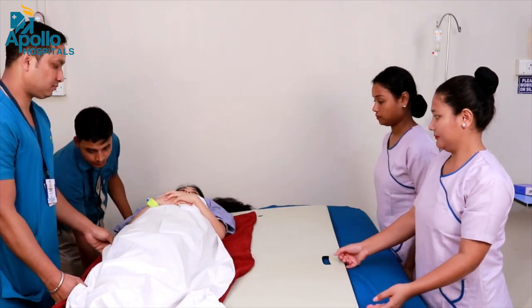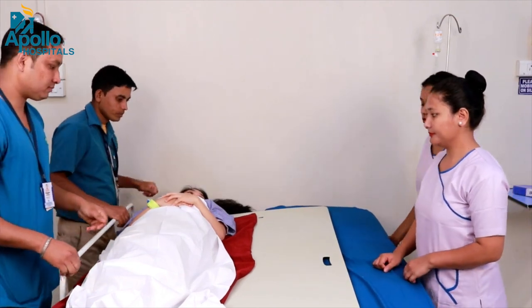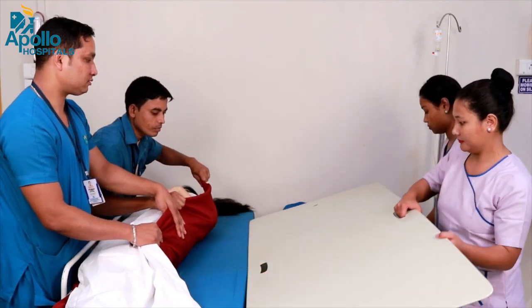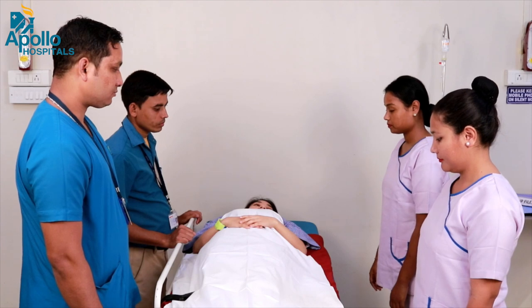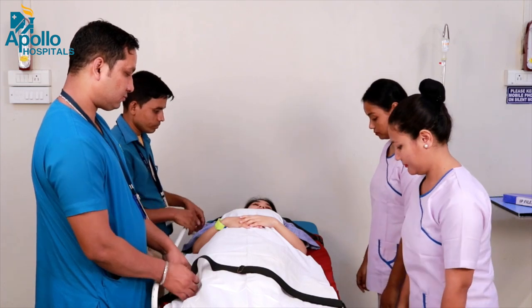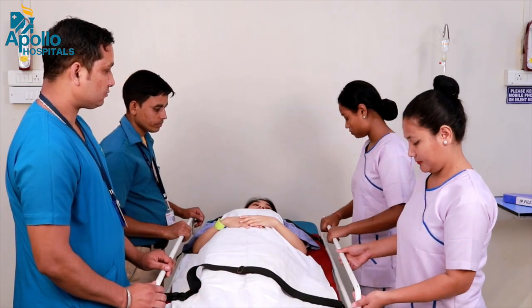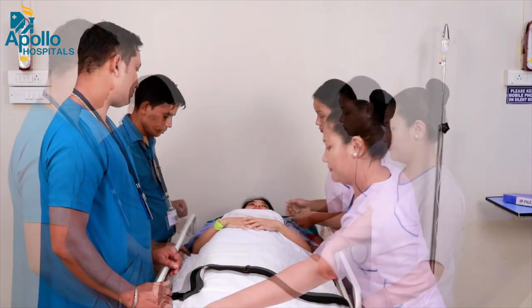Provide side rails to the patient. Put on the safety belts. And put the side rails of the patient in a comfortable position to the patient. Thank you.